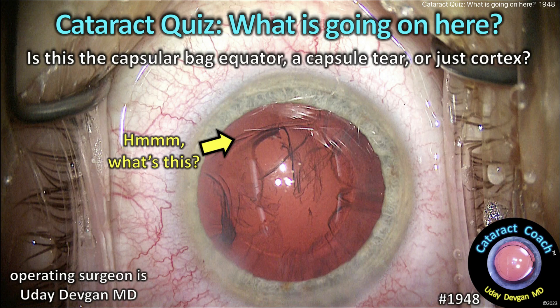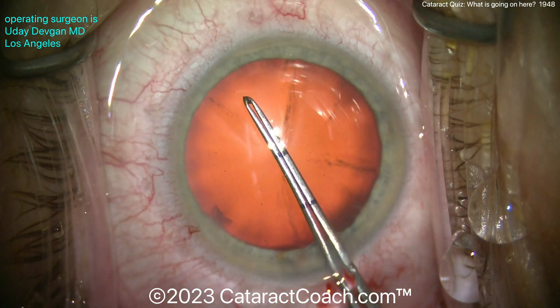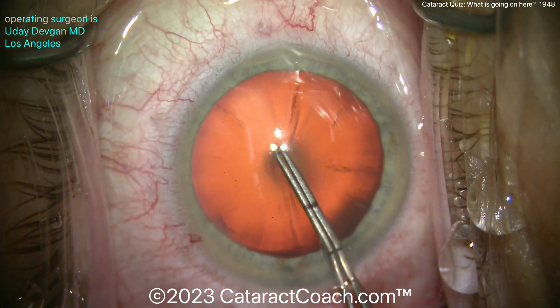CataractCoach.com cataract quiz: what is going on here? Is this the capsule bag equator, a capsule tear, or is it just cortex? Watch the case — I want to show you from the rhexis. There are some important clues here, so watch carefully.